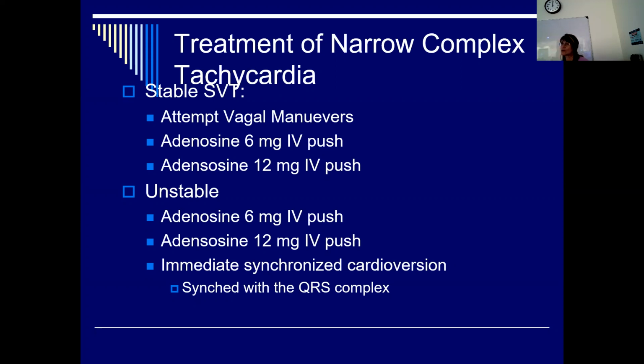It's called cardioversion when you use a small amount of voltage. So the thought is if you apply a small electrical shock to the heart, it's going to stop the cardiac conduction altogether. Then when cardiac conduction starts up, it'll start up normally. So that's the assumption, and hopefully it does. Sometimes it goes to asystole, but that's why you're always at the bedside when they're doing a cardioversion. But it's thought to stop the entire conduction system and let the SA node start doing its thing and taking over.